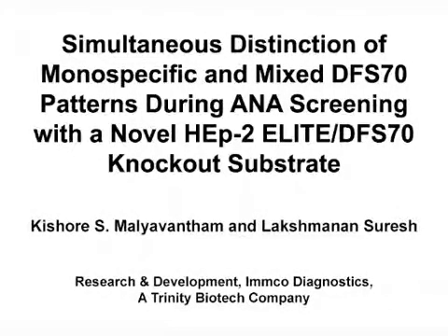The overall goal of this procedure is to demonstrate an improved indirect immunofluorescent assay that uses a novel HEP2 dense fine speckled 70 knockout substrate to screen antinuclear autoantibodies and simultaneously confirm monospecific and mixed dense fine speckled 70 patterns. The novel HEP2 substrate uses a standard indirect immunofluorescence procedure and interpretation criteria for screening of clinically relevant antinuclear antibodies, also known as ANAs. The main advantage is the ability to distinguish the dense fine speckled 70 pattern from disease-associated homogeneous, speckled, or challenging mixed patterns at the screening step.